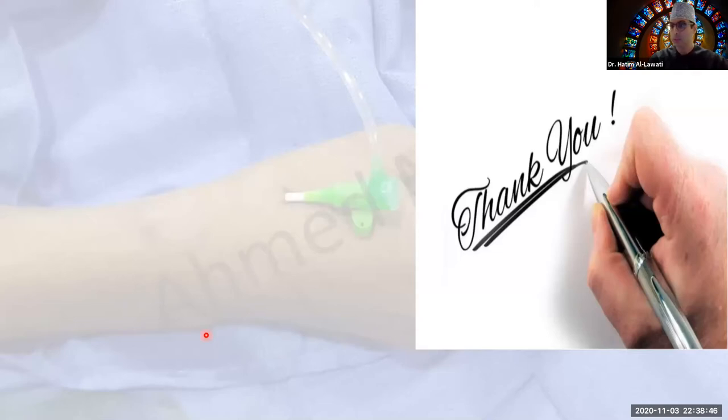But it could have also gone the other way. Ballooning or stenting that left main, especially if the operator decided to use a slightly oversized stent, might have induced a very bad no-reflow situation with TIMI 1 to 2 flow in the LAD, ramus, and the ongoing circ. And then the patient goes into shock and arrests repeatedly, then what, right? So it could have gone the other way as well. So like I said, there is no right or wrong answer because the situation is so unpredictable.